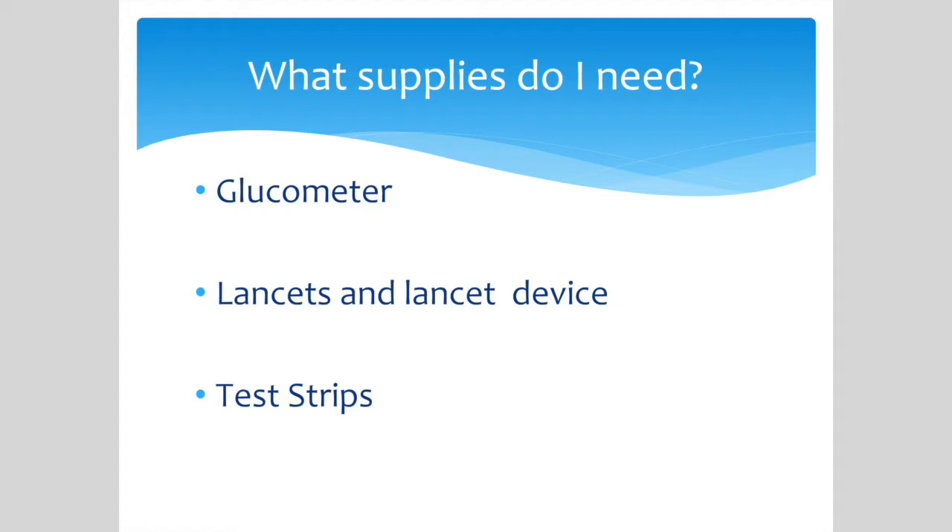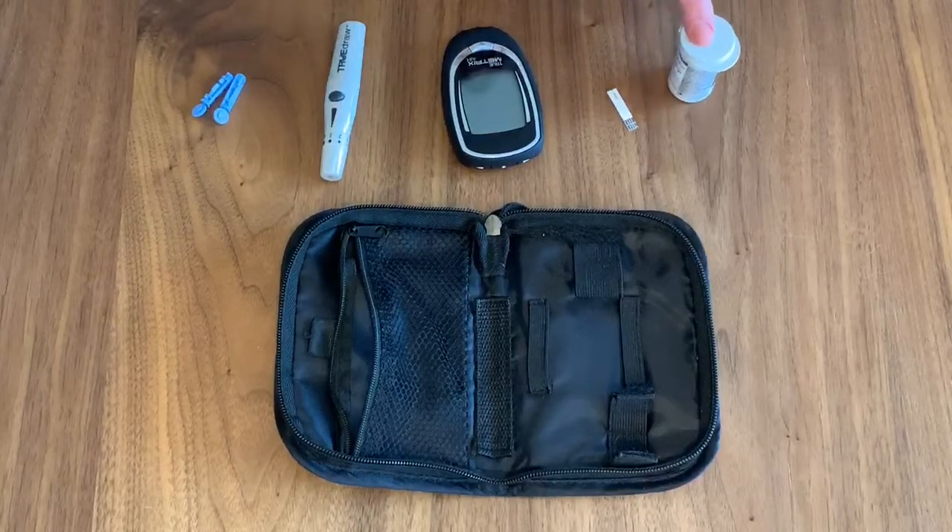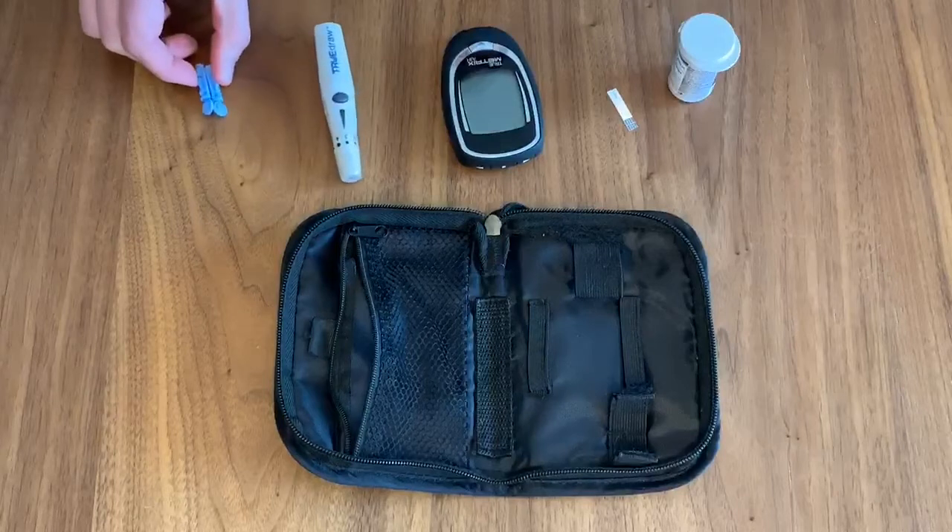Having good technique helps to ensure accurate results. Let's look at the components inside your kit. You should have a blood sugar monitor, a vial which contains testing strips, a lancing device to poke your finger, and a box of lancets.